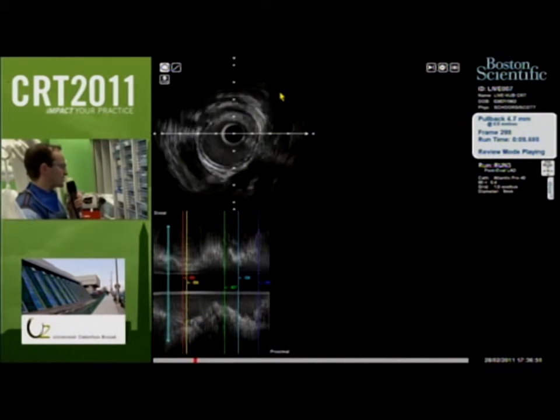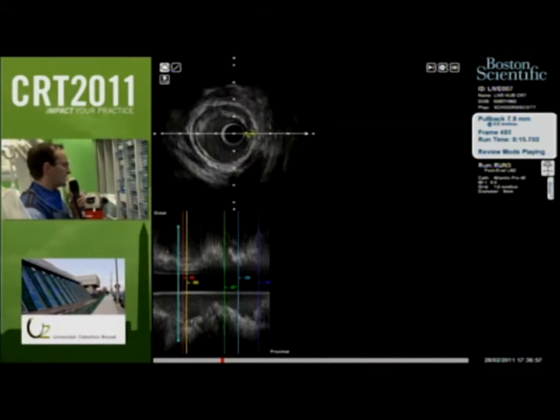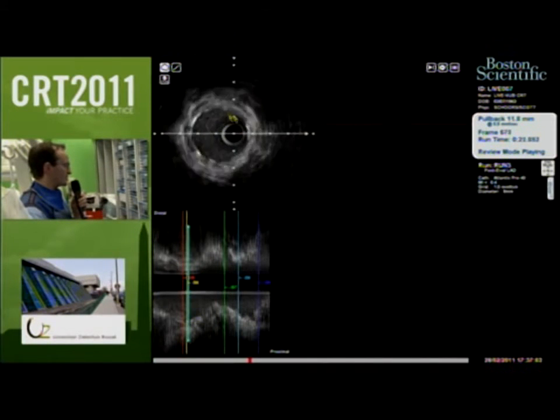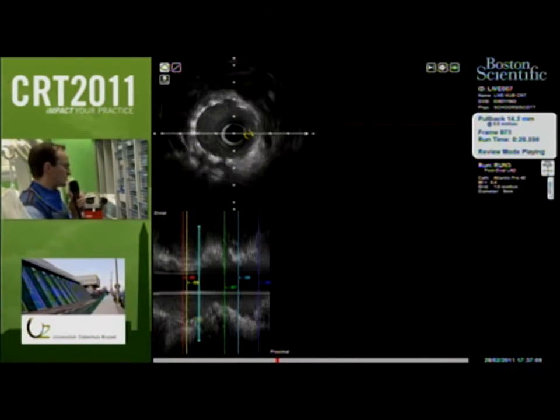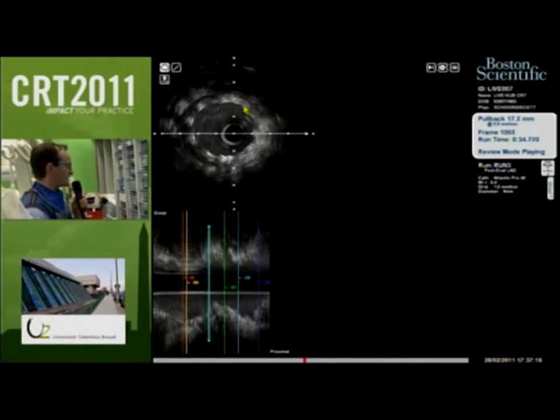You see the systole-diastolic change, and you have some eccentric plaque at this level. This is an LAD around 3.2 millimeter in diameter, and you see a perfect distal apposition of the stent. The minimal area there was around 7 millimeter square, and you see that this bifurcation stent is very nicely concentrically well apposed.